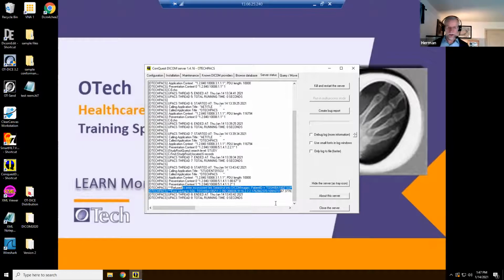So this was a very good demonstration of two simultaneous errors. One was that a presentation context was not supported, so it was rejected. And the other one was, we will not be able to accept this image, right?